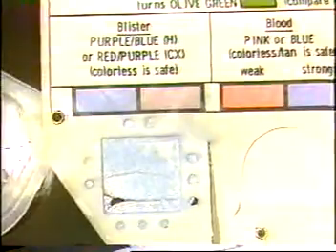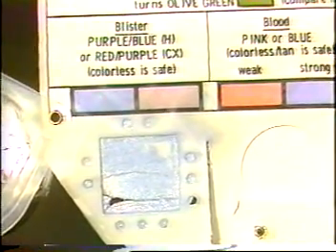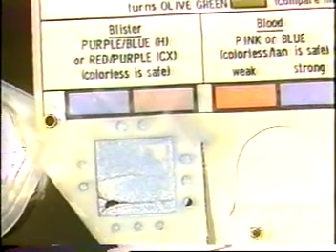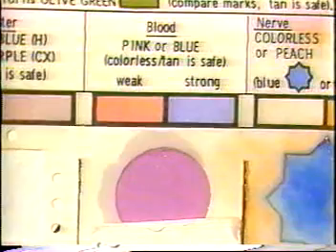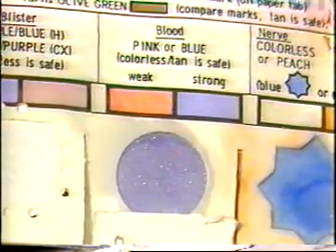When the two-minute time period is up, check the test spots. If a blister agent mustard is present, the test spot would be blue, indicating the presence of a vapor blister agent. If a blood agent is present, the test spot would be pink or blue, indicating the presence of a vapor blood agent.